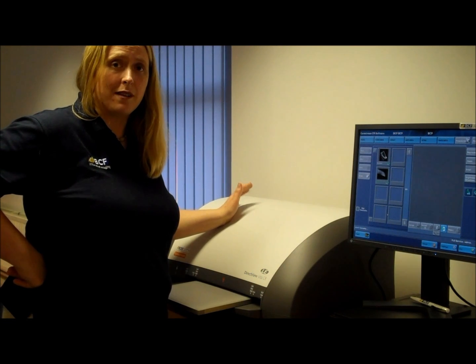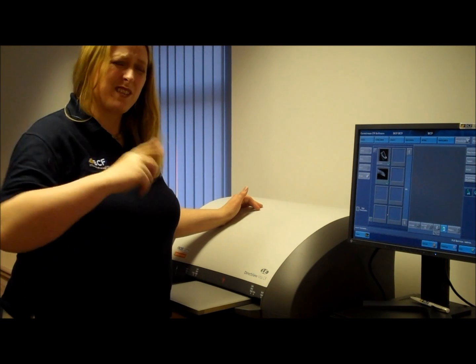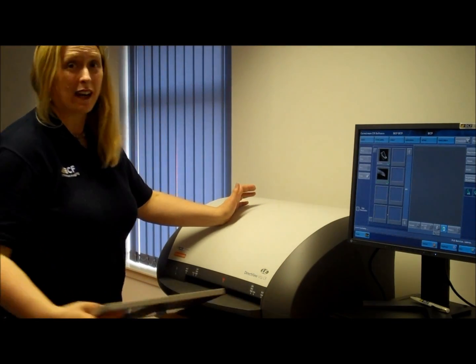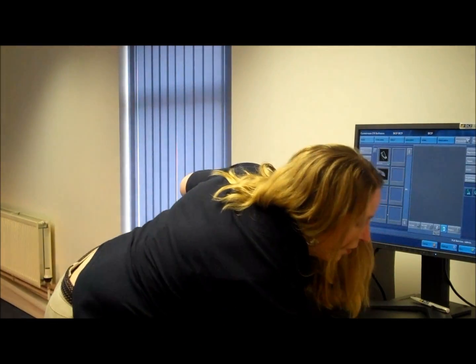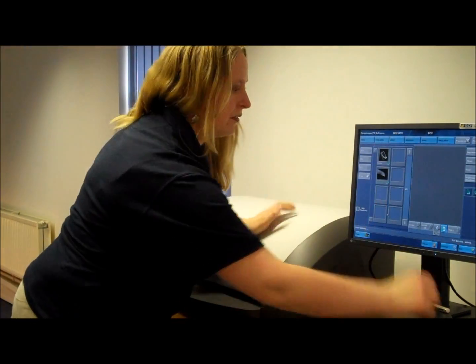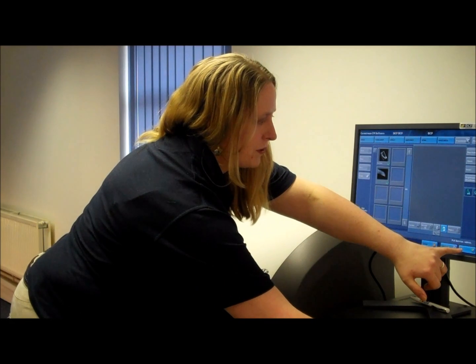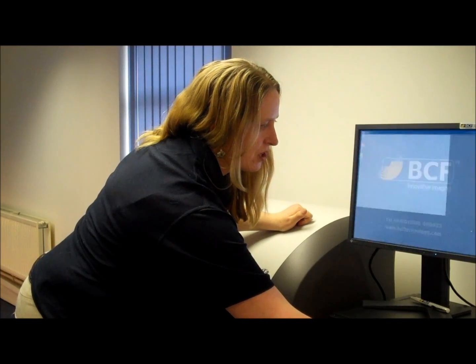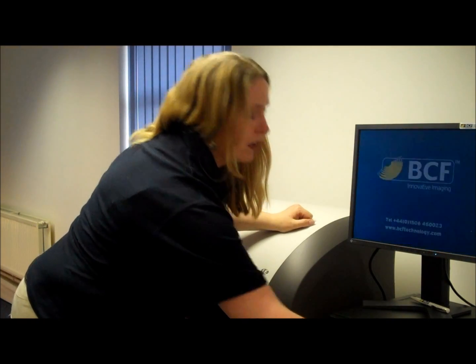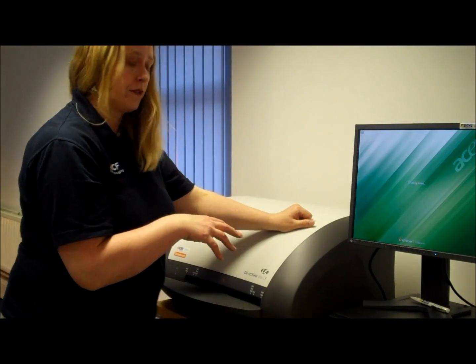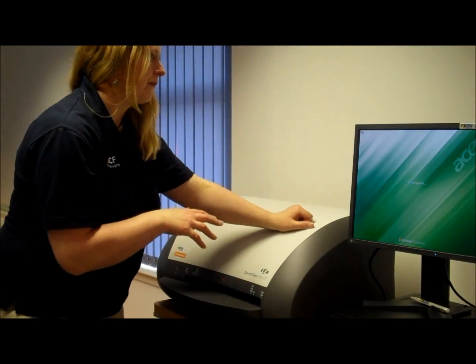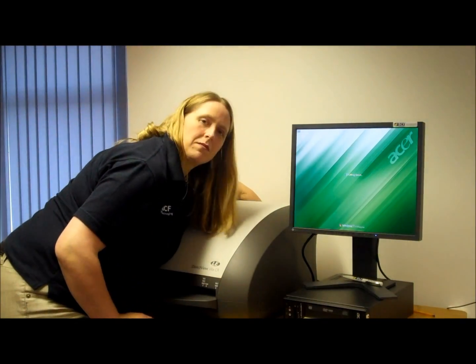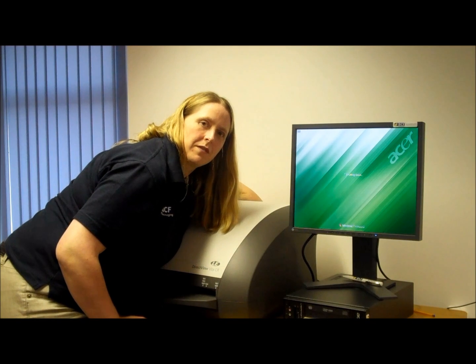Turning the system off is really simple, but it is quite important to take your last plate out before you do so. All you need to do is, on the bottom corner of the screen, exit and shut down, and the computer and monitor will turn themselves off automatically. Then reach over the back of the system to the on-off button. It takes 30 seconds to switch off.